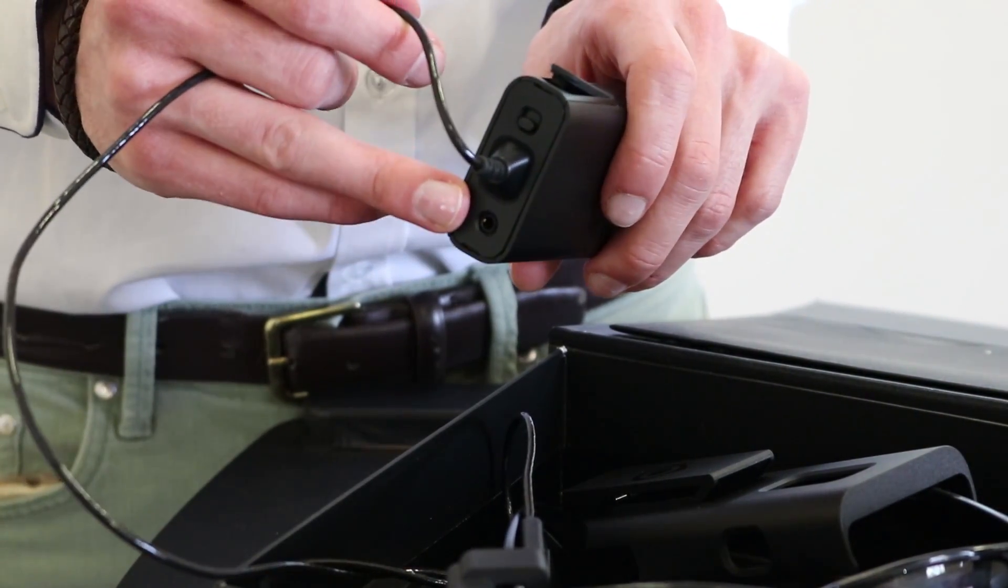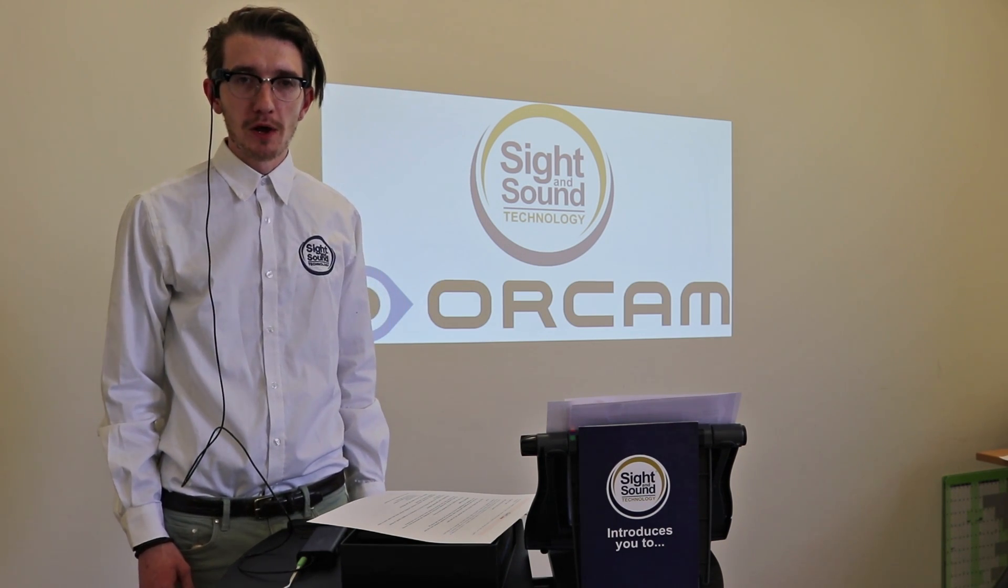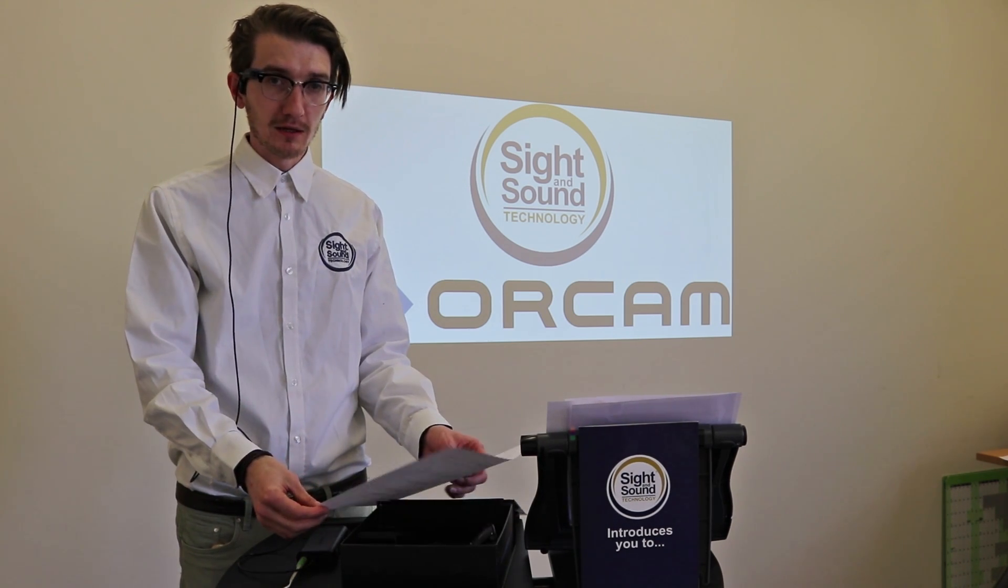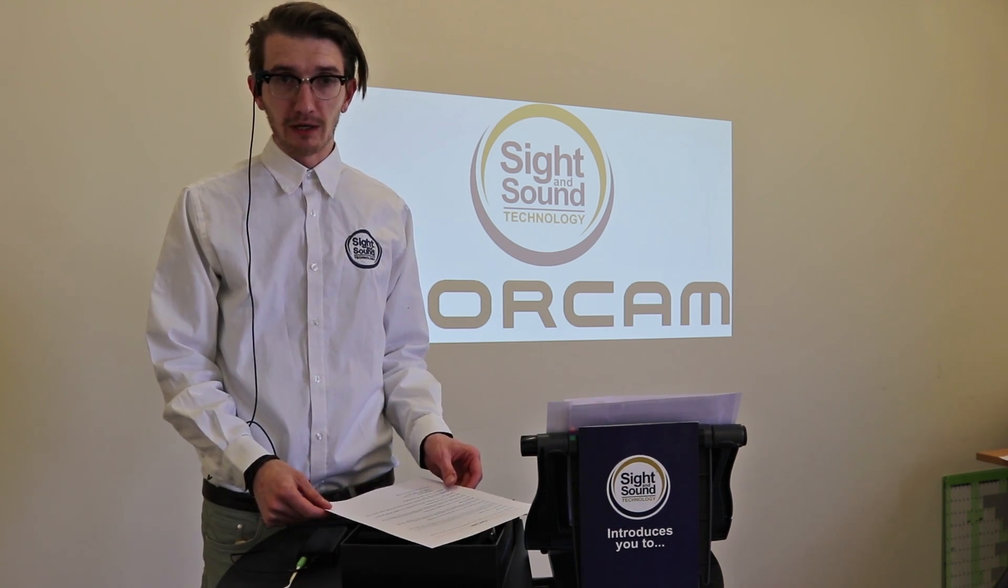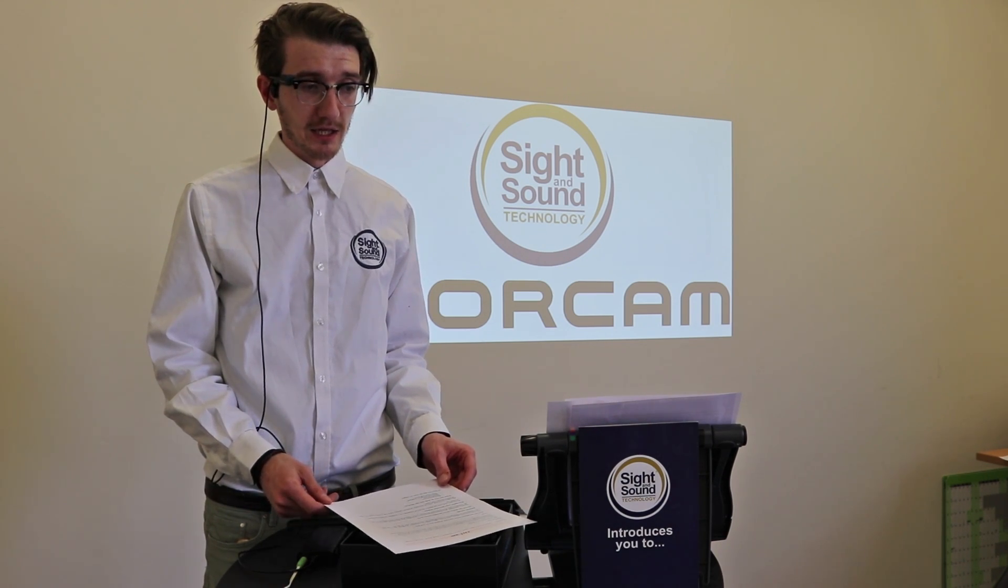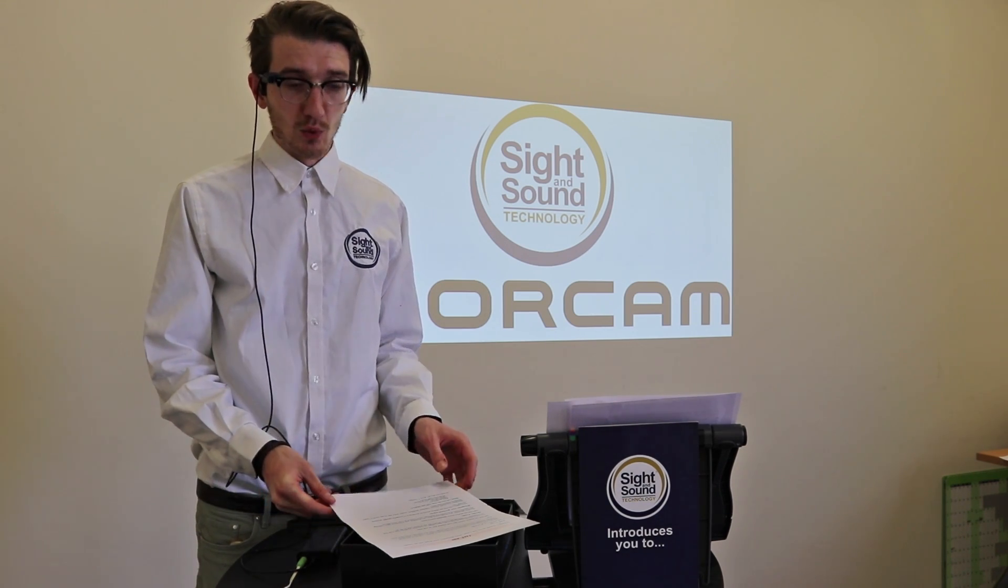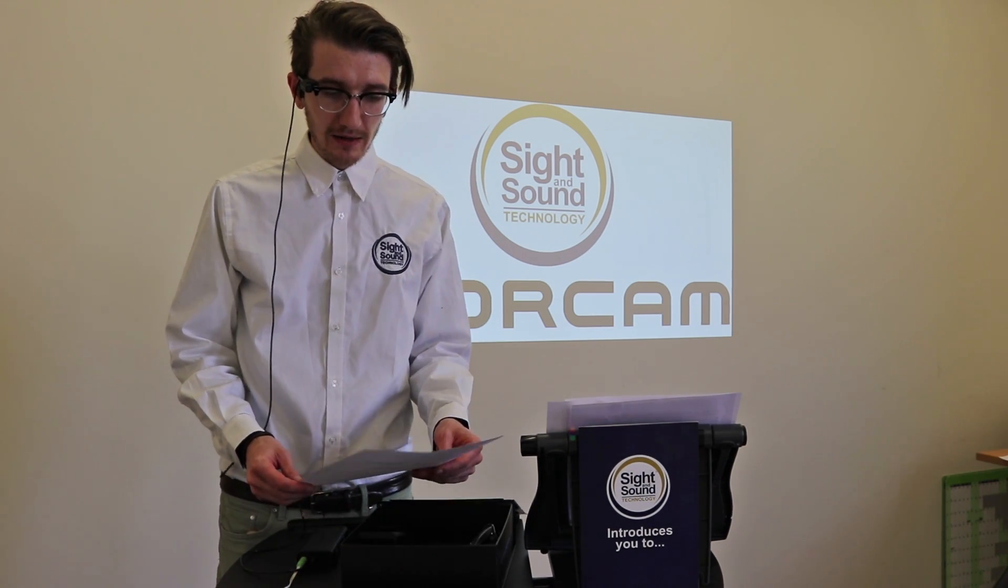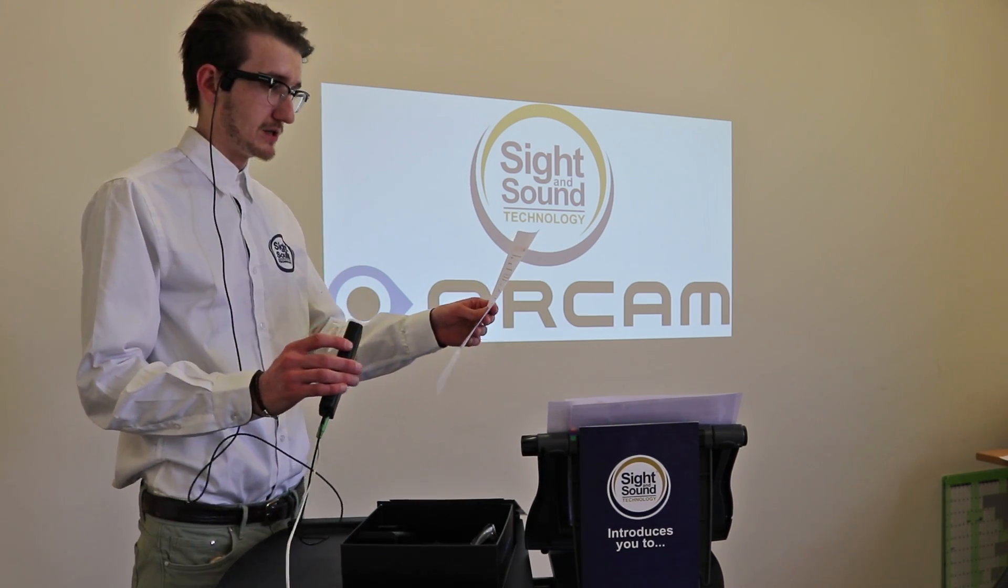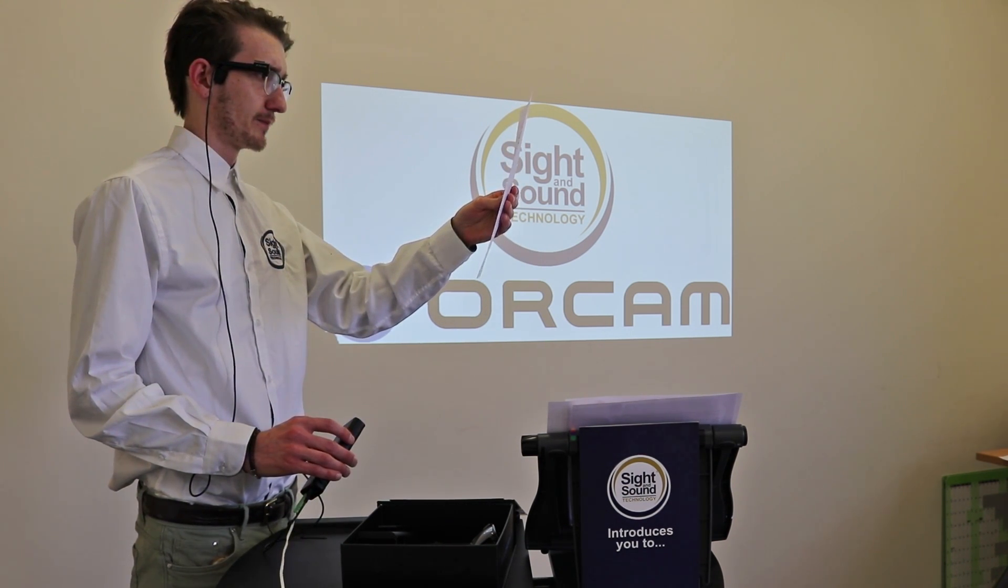So the OrCam comes in two variations: we have My Reader and My Eye. The My Eye is the one we've been demonstrating today. The My Reader is great for text reading but it does not do the object recognition or facial recognition. The My Reader also has a one year warranty whereas the My Eye has a two year warranty. So let's demonstrate how to do the text reading. I'll do it showing you with the base unit so I'll press the trigger button on the side of the base unit.